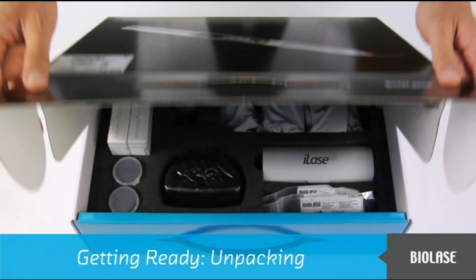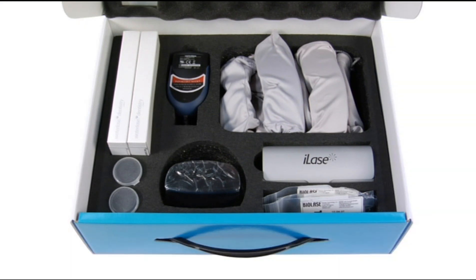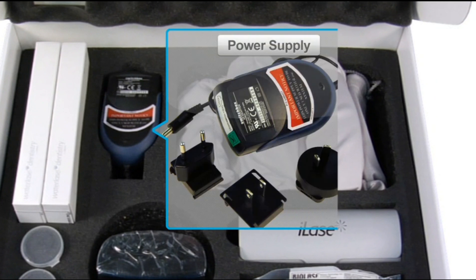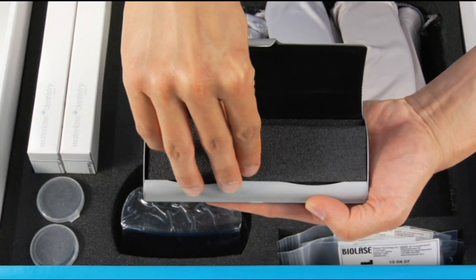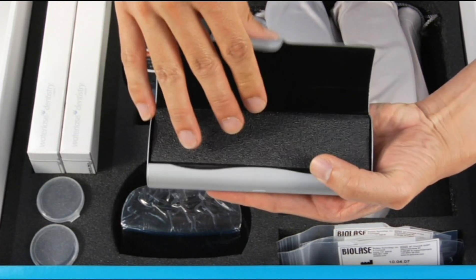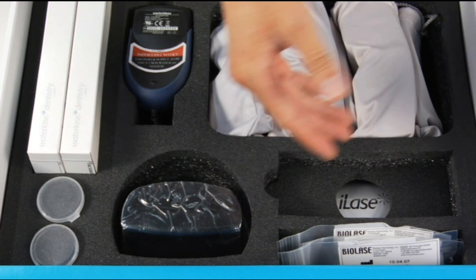Begin by unpacking and setting up your iLaze system. Inside the box, you will find a charging station, a power supply with plugs for the charging station, and a handpiece carrying case, which contains a handpiece with cover and two batteries. If you have purchased a system with two handpieces, you will find the second handpiece placed below the first.